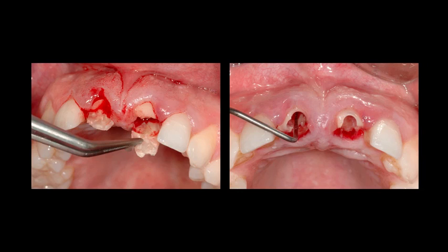But we would do everything we can to make this work. I actually had the surgical treatment completed by a periodontist colleague of mine, Dr. Jim Janikowski. Jim was removing the teeth for us, and he removed all the little bits and pieces that were fractured, and then he essentially drilled out the roots because we wanted to remove the roots as atraumatically as possible. He drilled a big central post space in the roots and then imploded the little pieces inward so that we wouldn't damage the soft tissue and the bony architecture.